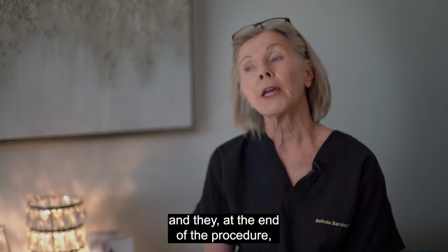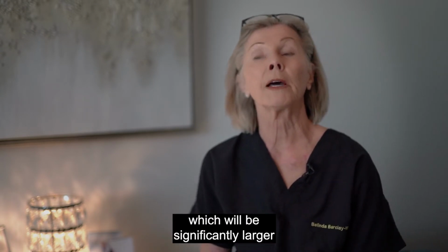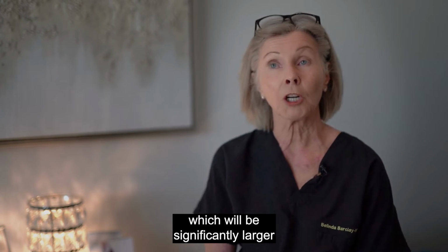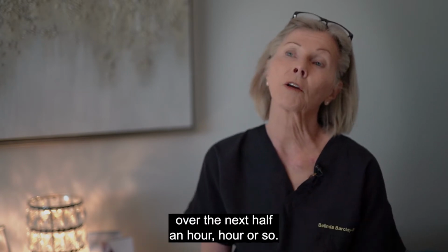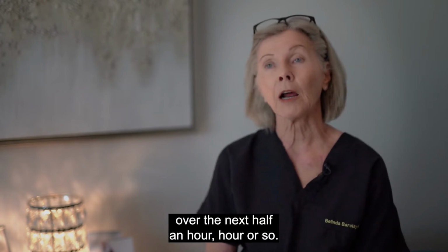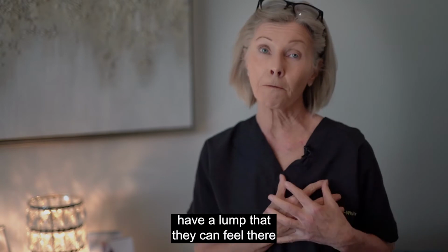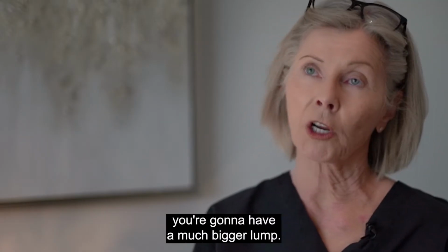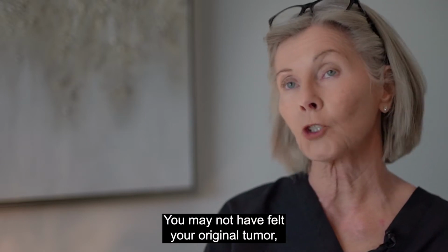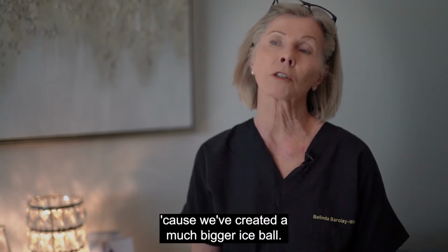And at the end of the procedure, they can feel this big cold ice ball in there, which will be significantly larger than the original tumor. And then that melts gradually over the next half an hour or so. And the patient will then have a lump that they can feel there. And we warn them, you're going to have a much bigger lump. You may not have felt your original tumor, but you're going to have a bigger lump now, because we've created a much bigger ice ball.